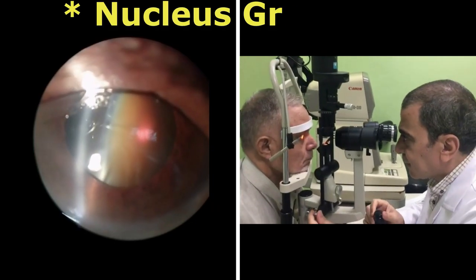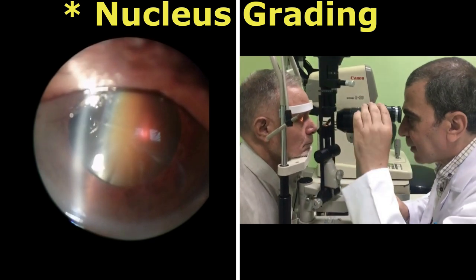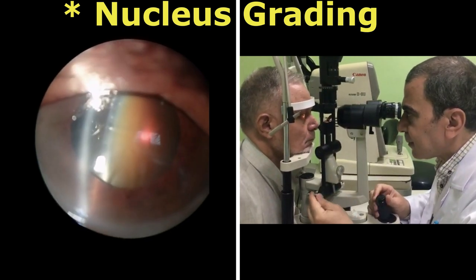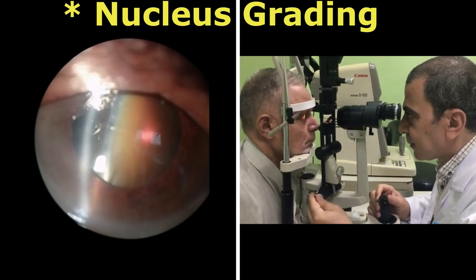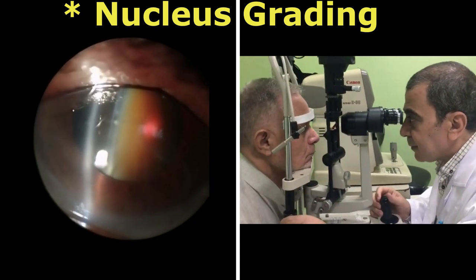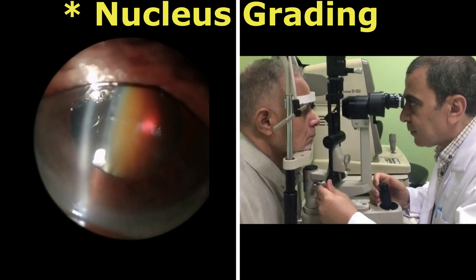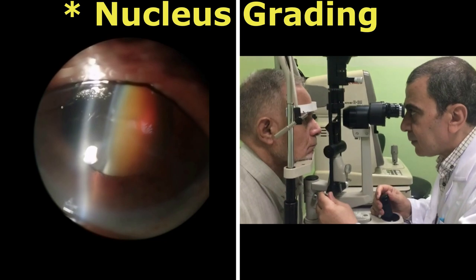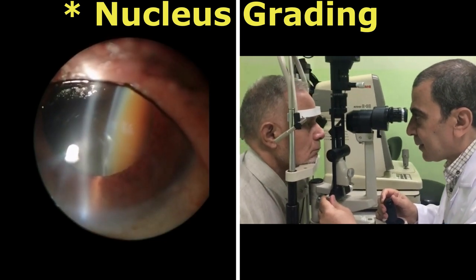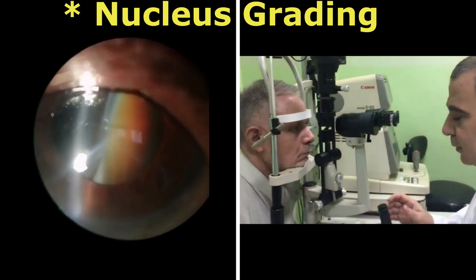A higher variability in polymegethism and polymorphism correlates with aging. Dense nuclear cataracts require more ultrasonic energy and prolonged surgical times. Also, they are more prone to turbulence and shattering during phacoemulsification and are technically more difficult to operate on.